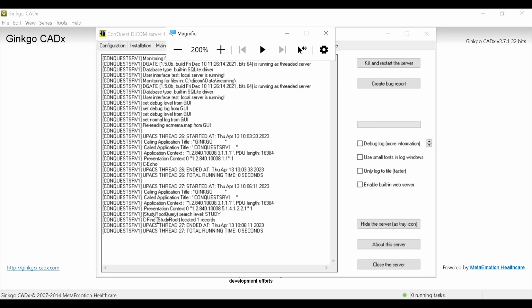C find, C being a command that we're having it do. By the way, there are two different types of commands, C types and N types. They call it composite and normalized, but really I just remember it as you've given a person a command, they're doing something. Normalized is the software is doing something. So if you see an N type, it's software requesting things. And those of you that know DICOM know I'm making some pretty big glossing overs right now. That's okay, because functionally what I'm telling you is about an 80 to 90% hero. Let's move on, right? So C find, and it sent one record, and then it stopped the communication, right?